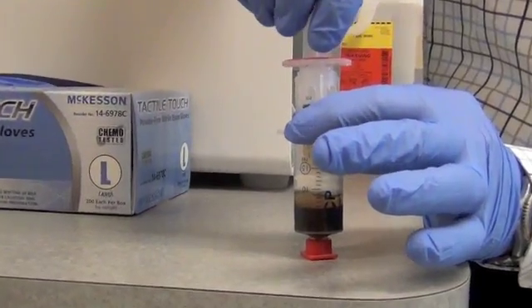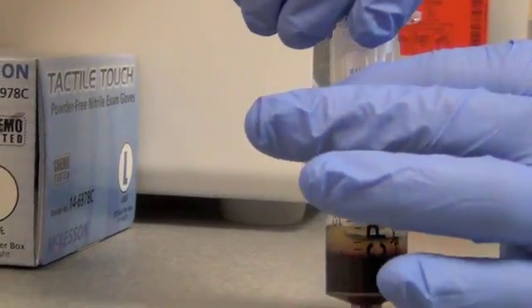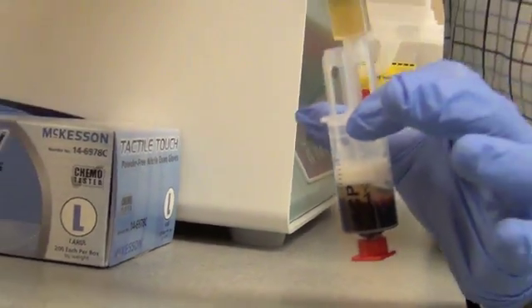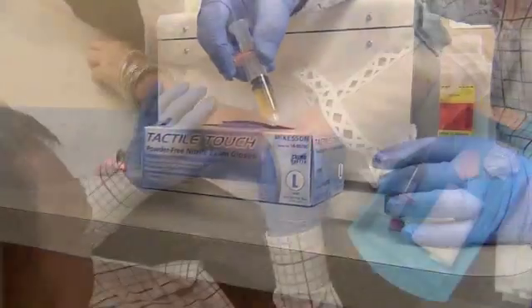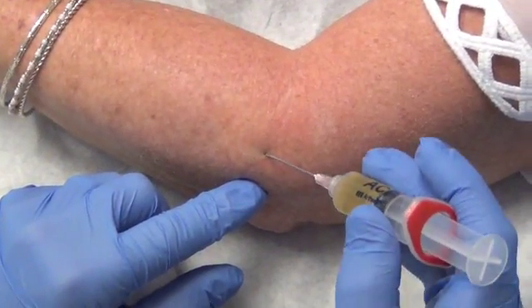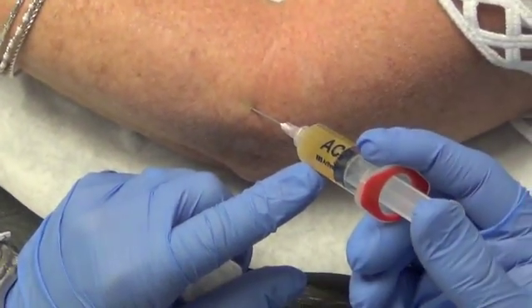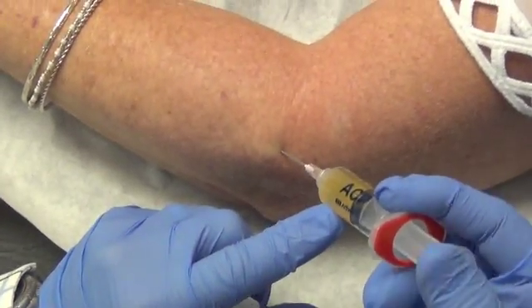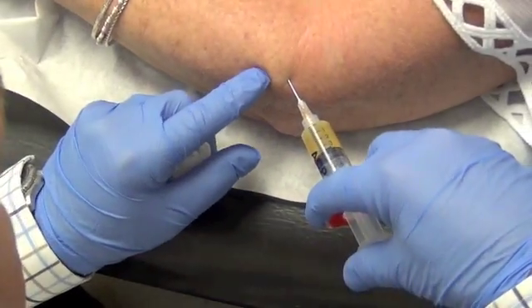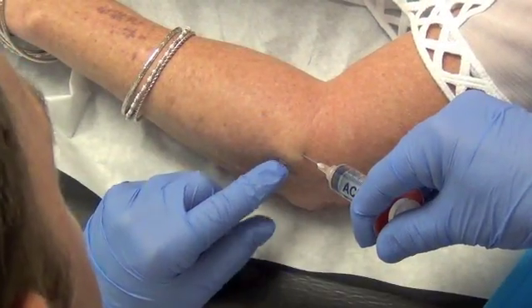Once we have that separated, we can then inject the platelets into the patient's problem site. We will sterilely prepare the area and then inject the platelets into the area of the common extensor tendon where there's pain and diseased tissue. The purpose being to optimize the chances of getting these areas to heal properly.